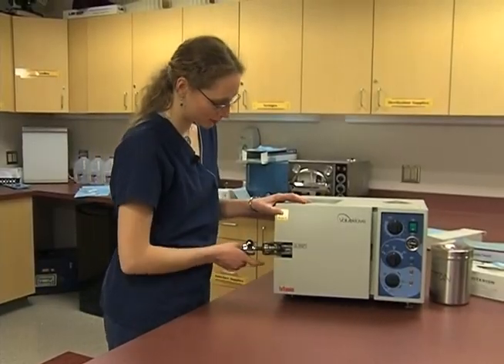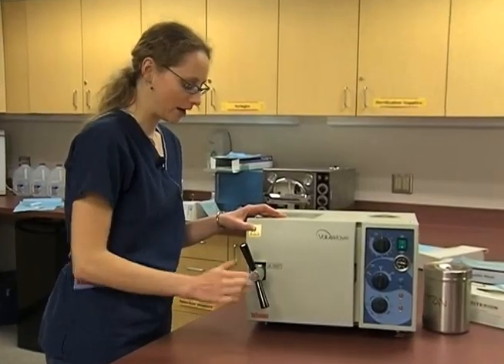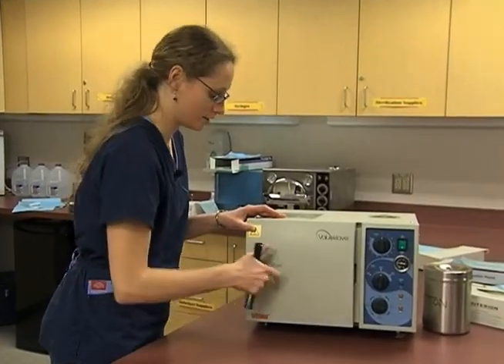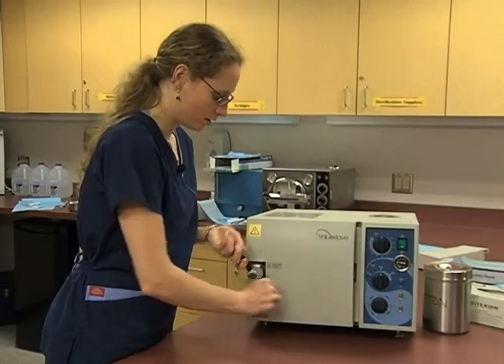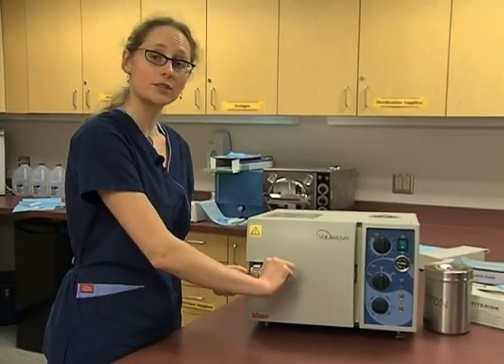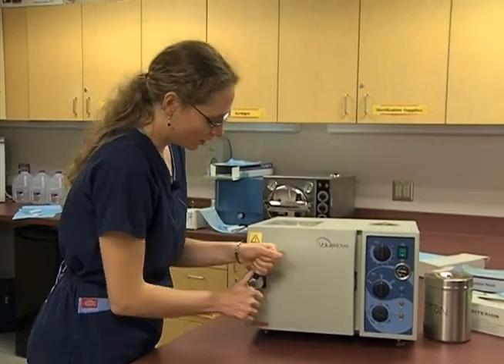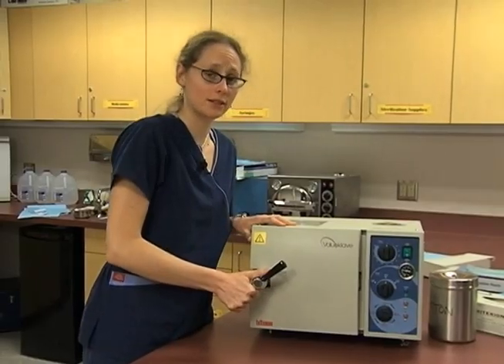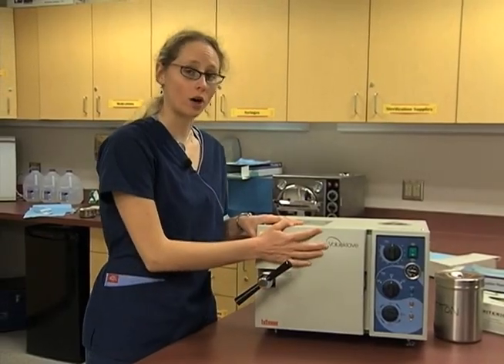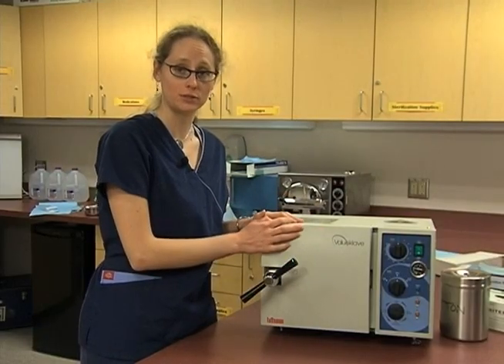Now we want to secure the door — each system is going to be different. In this case, we have a crank to make sure that the door is secured and tight. Other autoclaves have a gasket system and a latch. We want to make sure this is really nice and tight, because we don't want it to open up — we need it to reach a certain amount of pressure, so that chamber has to be sealed.